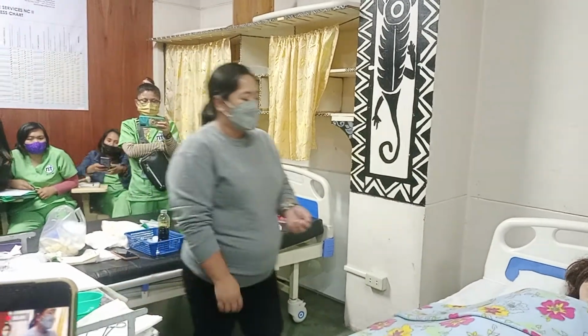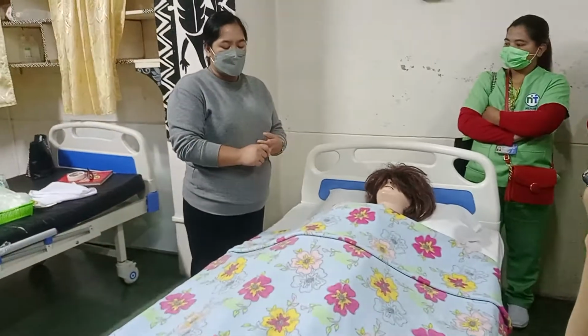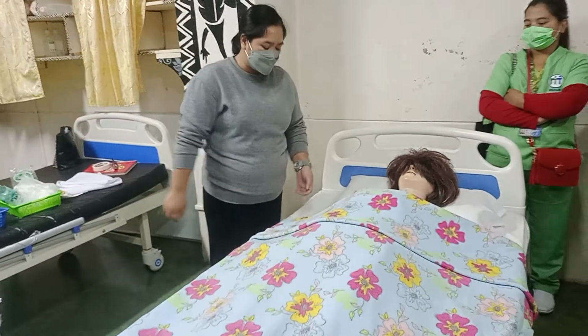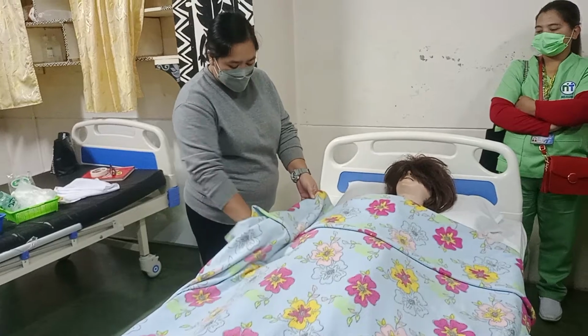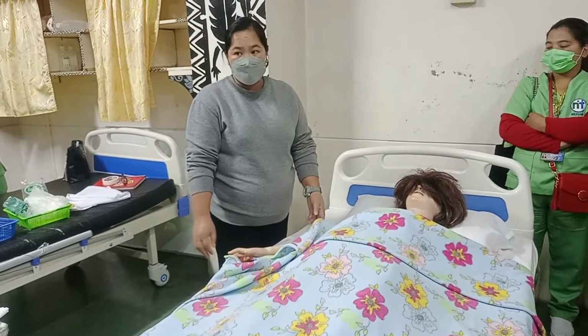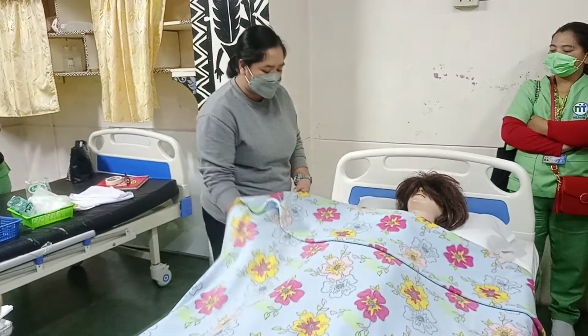Okay, good morning, Ma'am Smith. I am Grace. I am your caregiver for today, and I was tasked to insert your catheter. Now, before we proceed with the procedure, ma'am, can you state your name and your address to verify that you are my patient? Sabi niya, siya si Mrs. Smith. Thank you for the information, ma'am.